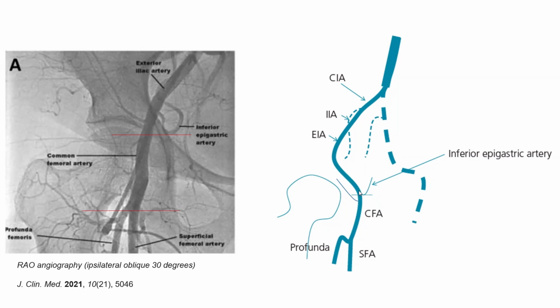You have a 5 to 17 times higher risk of what we call pelvic or retroperitoneal bleed. So it is very important to understand the 3D imaging, why this point here is much deeper than that point here and much more risky in terms of bleeding than that point here. You may not appreciate it on 2D angiography.